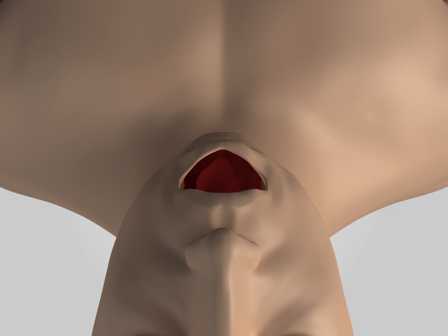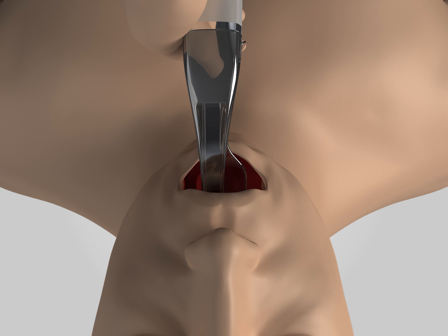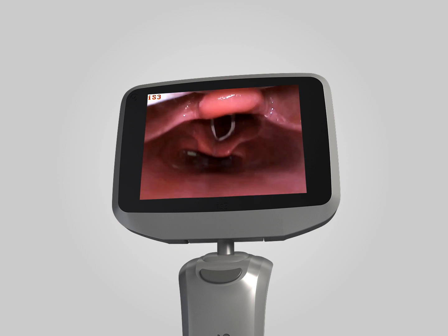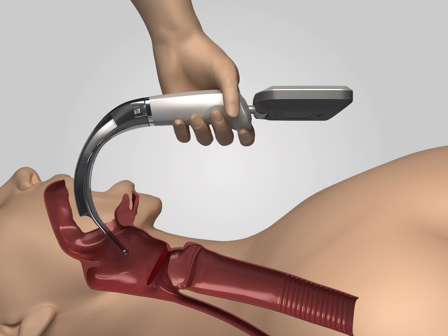4. Operating points. Look straight at the patient's oral cavity and insert the tube along the midline of the mouth with the front end of the blade reaching the uvula area. Look at the display to propel the laryngoscope and gently lift it up after seeing the epiglottis to get the best view of the glottis. Avoid pushing the blade too deep.